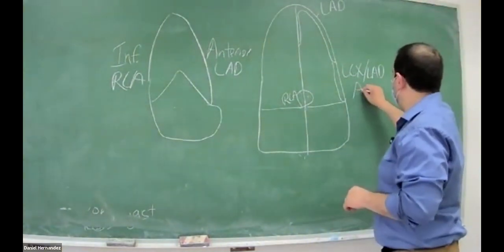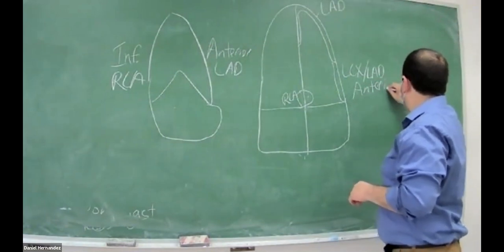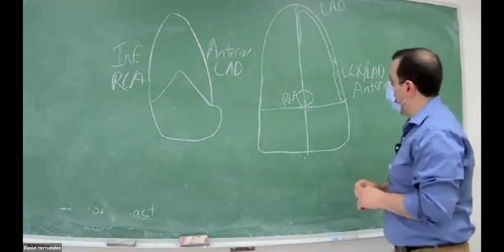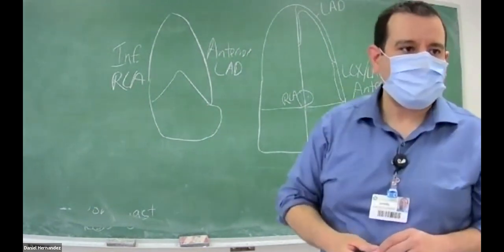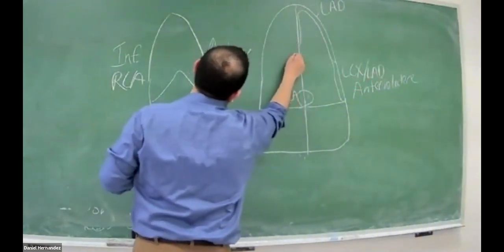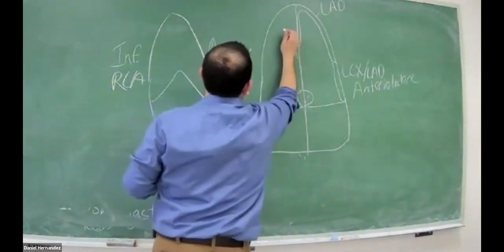It's going to be lateral. This is inferoseptal.